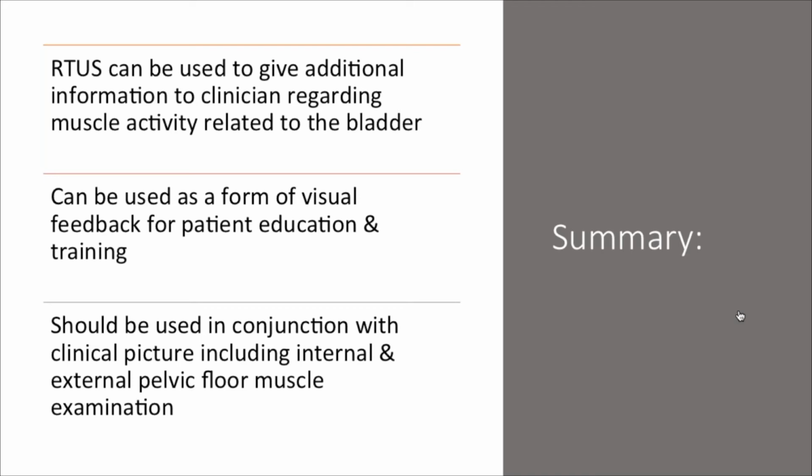She was able to highlight as well, if she's able to look in ultrasound and find muscles that may not necessarily be contracting or relaxing in the way in which she anticipated, that's correlating with her findings and the patient's subjective complaints, and she wasn't able to address it with breath or external treatment, it was very easy for her to take her findings and come to me and say, I'm seeing this on ultrasound, this is what we're seeing externally, this person may need an internal consult.